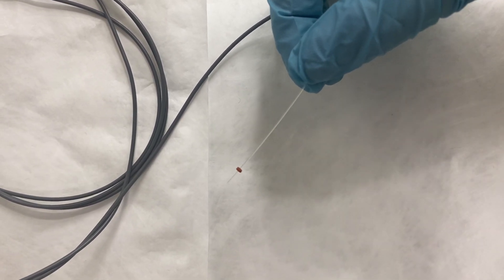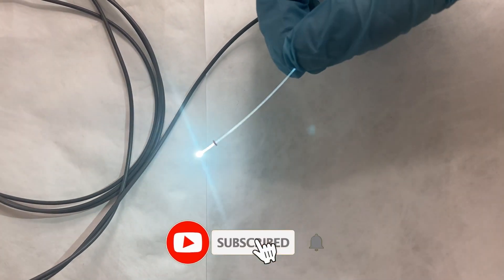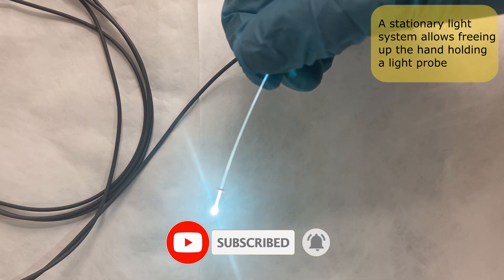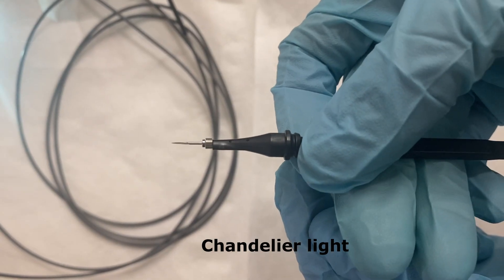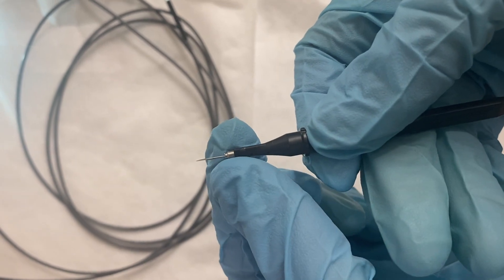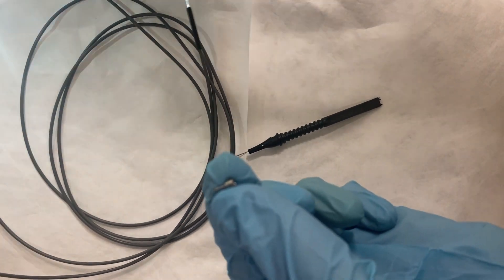The first technique for performing non-assisted scleral indentation and simultaneous vitreous base shaving consists of using a stationary light system, which allows freeing up the hand holding a light probe. Chandelier light is an excellent example of a stationary, diffuse, wide-field illumination system, allowing the surgeon to perform scleral indentation with one hand and vitreous shaving with the other.